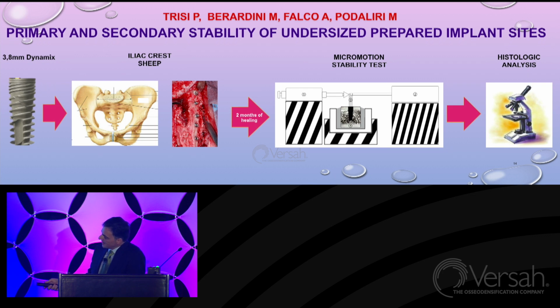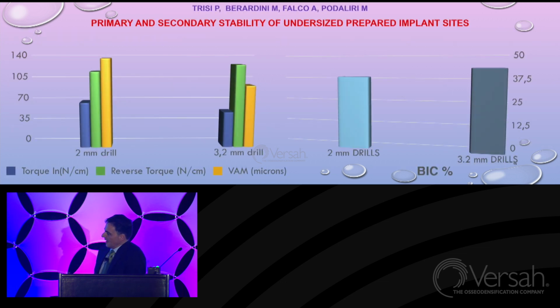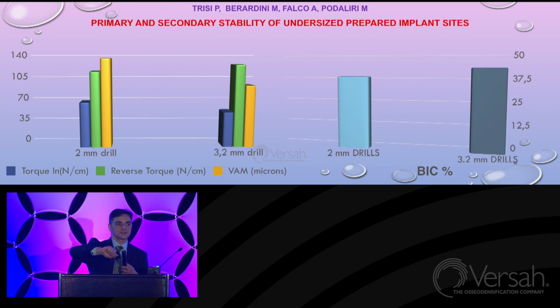So we place the implant in the iliac crest, like you can see here, then wait 2 months for healing. Then we make a stability test, lateral displacement, and we also made histologic analysis. And here you can see the results. This is 2 millimeter drills and 3.2 millimeter drills, which is the standard preparation for these 3.8 implants we used. And here you can see insertion torque and reverse torque. We try to unscrew the implant to test the reverse, rotational stability. And we also measure the lateral displacement, mobility, micro movement.